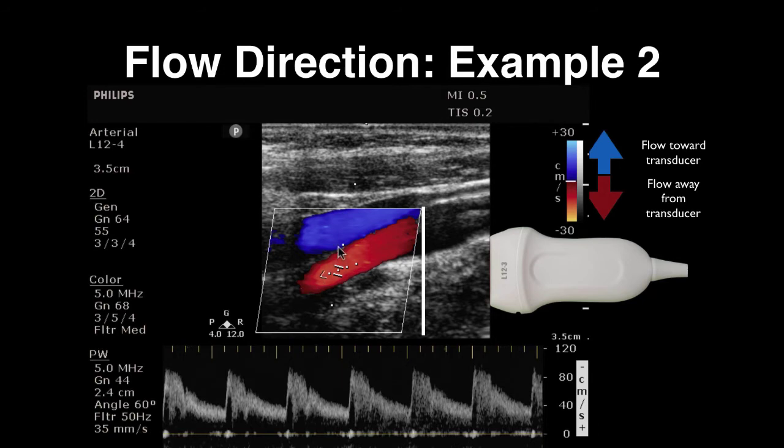And that's what you would expect because these two vessels here, this is the internal jugular vein, so flow is going, because orientation is anterior, posterior, head, foot, flow is going from head down to the torso, and for the carotid artery, it's going from the torso up to the head.